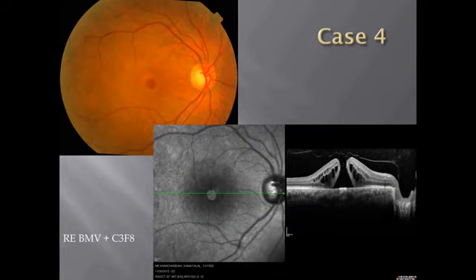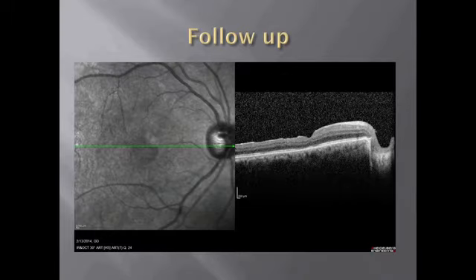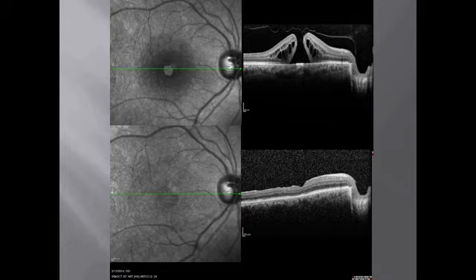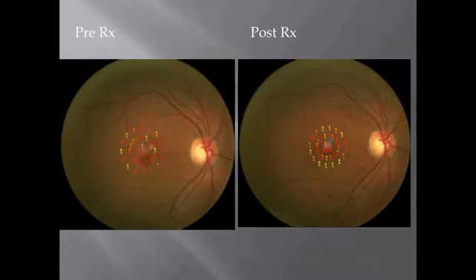Macular hole is another area where you could document what's happening pre and post-op. This is a classic case. Your patient undergoes surgery. This is the pre-microperimetry pattern, what you see. On the follow-up, you have a closure, and then when you do the scans, it takes a while. We've seen it can take up to 3 or 4 months to sometimes have better recoveries. Initially, you might still see a lot of red in that area. This is the pre and the post, and here you still see some of the red which is there.